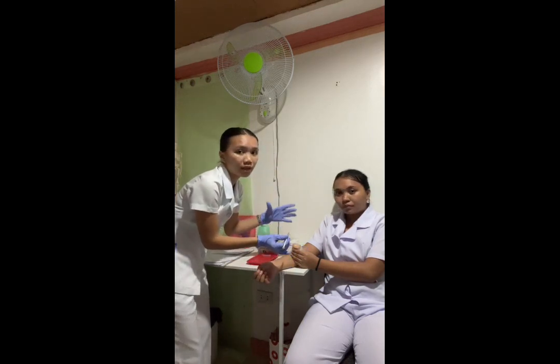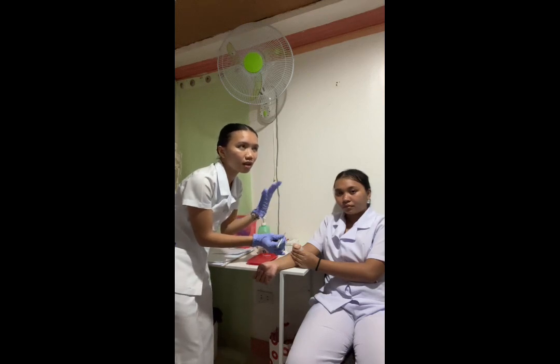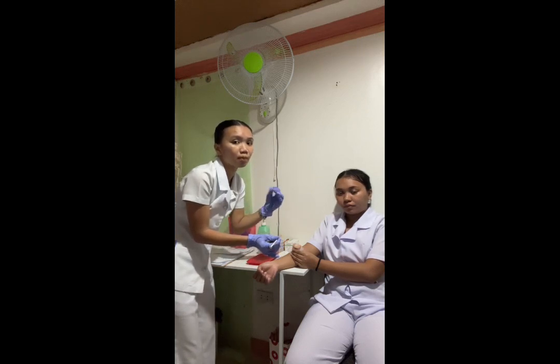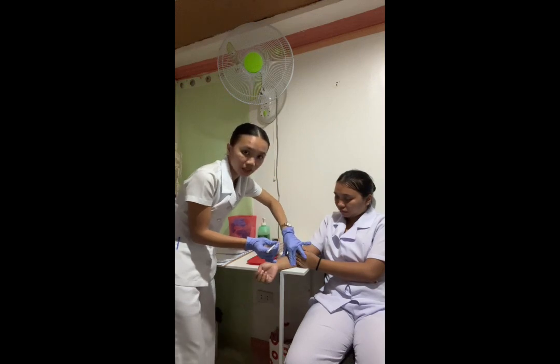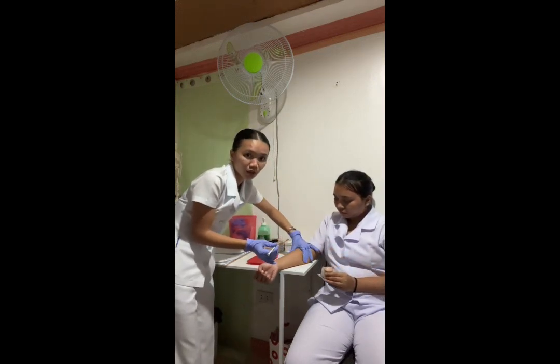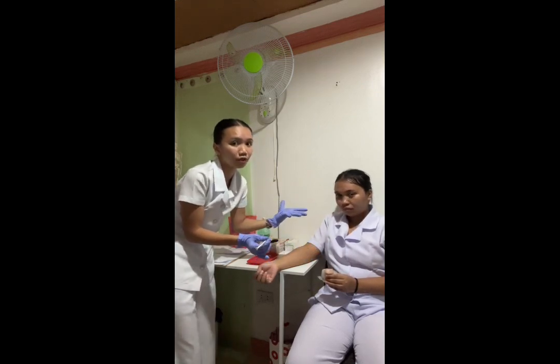So with the non-dominant hand, we have to pull the skin at the site until it is taut. For example, if using the ventral forearm, grasp the client's dorsal forearm and gently pull it to tighten the ventral skin. So we are just going to do like this, like this one, because taut skin allows for easier entry of the needle and less discomfort for the client.